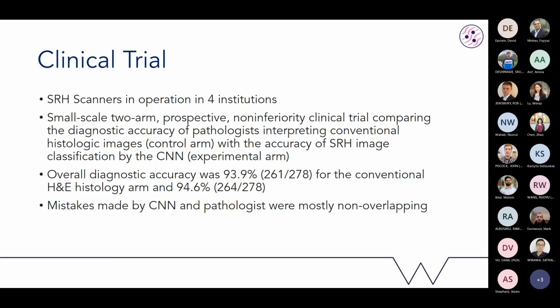So it's basically able to say, okay, this example is outside of my area of expertise, I can't do this. And they excluded 13 particular rare types of tumour using this method. So that's good and bad both together, I guess, because it slightly weakens this result, but it's good that they are able, using this AI pipeline, to identify what sort of examples their AI will not work on, essentially.